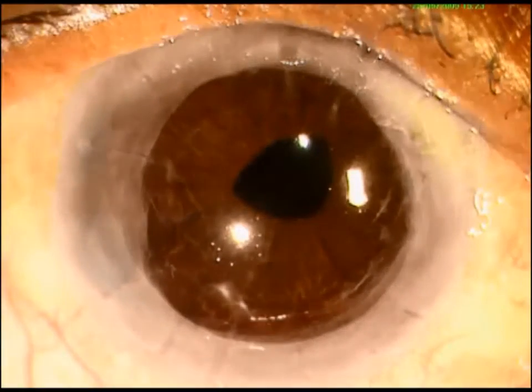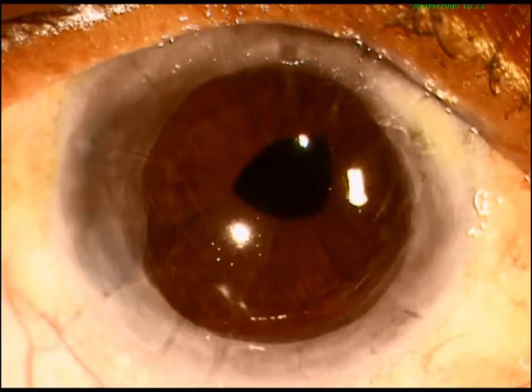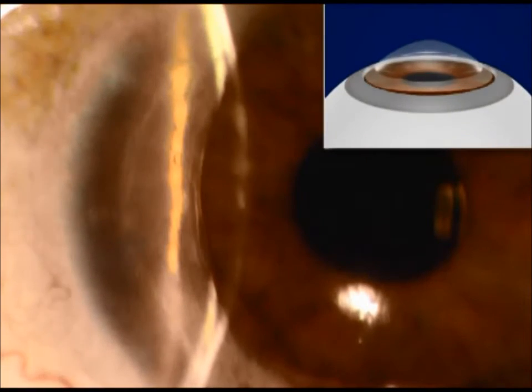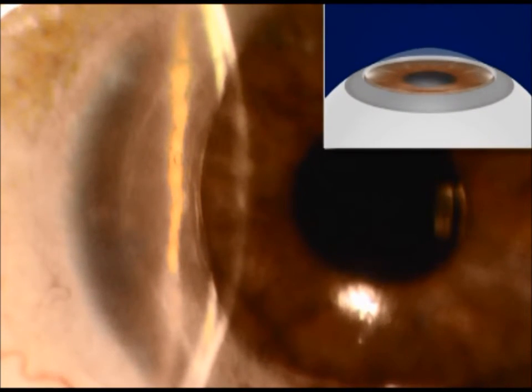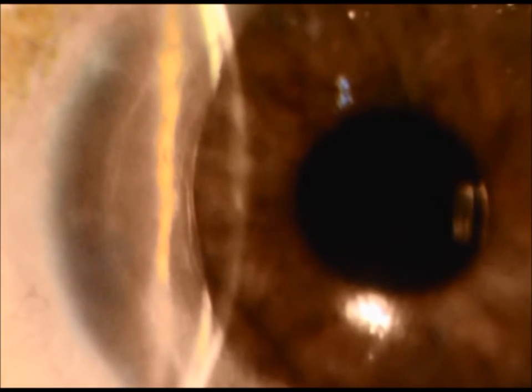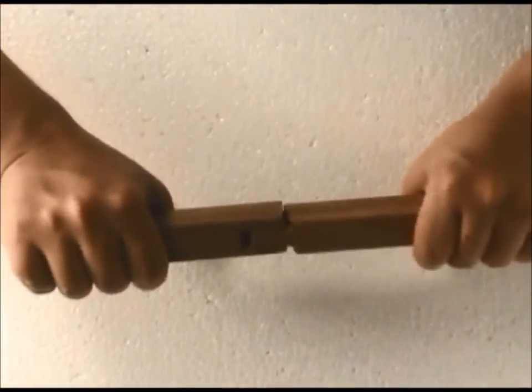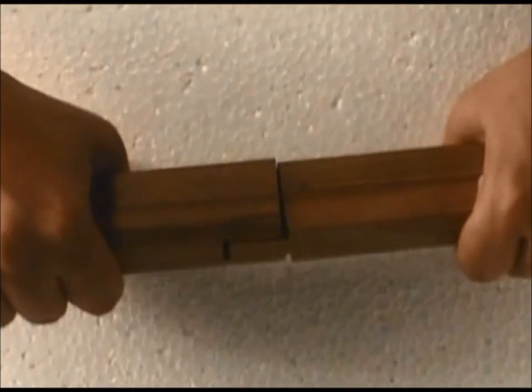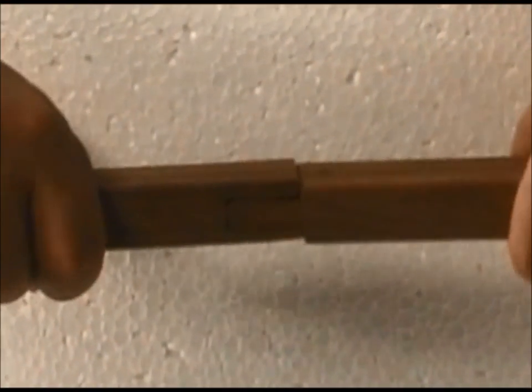The central part is a full-thickness corneal button, which confers the optical superiority of a penetrating graft. The wound configuration resembles a lamellar keratoplasty because of surface-to-surface opposition rather than edge-to-edge opposition. This leads to the strengthening of the bond between the donor and the host cornea.